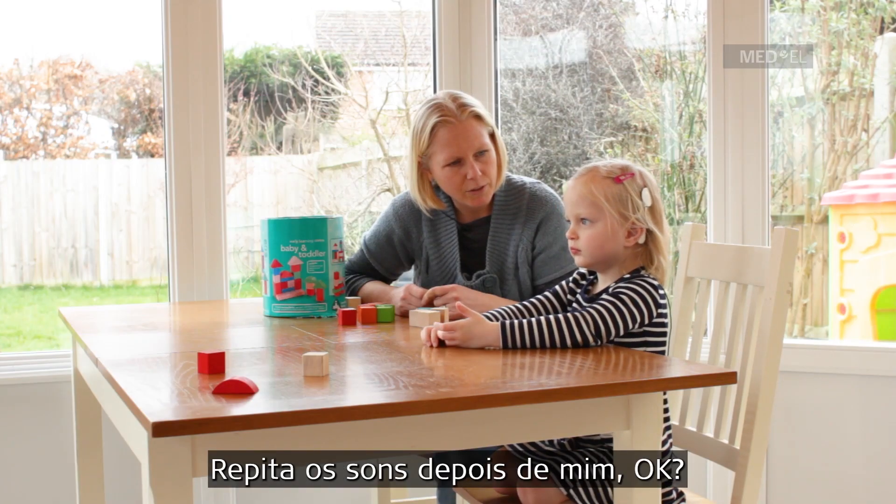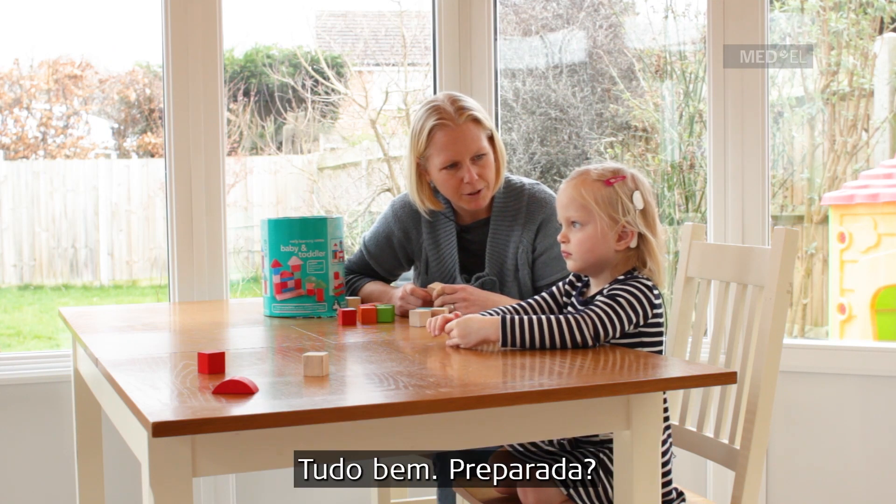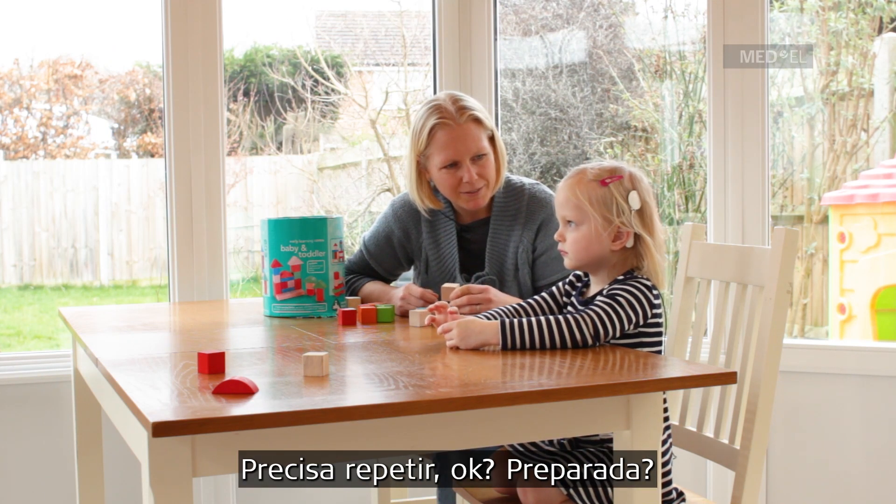So you say the sounds after me, okay? And then when you say the sounds you can put a block on the tower. Alright? Ready? Gonna copy me?